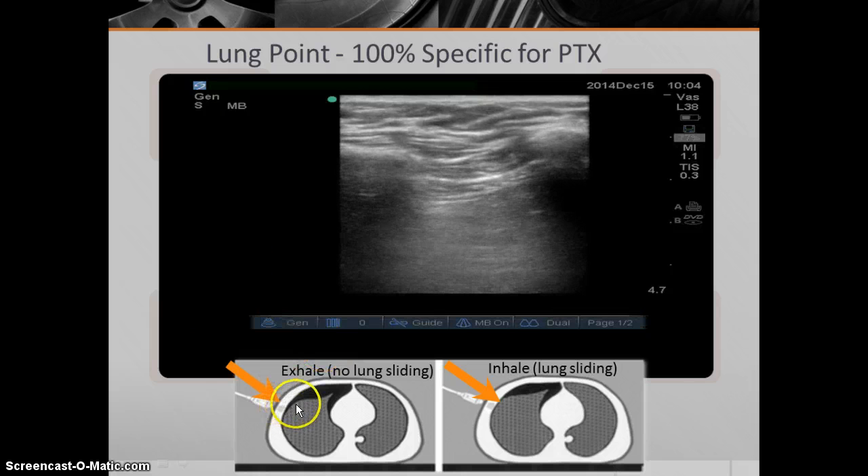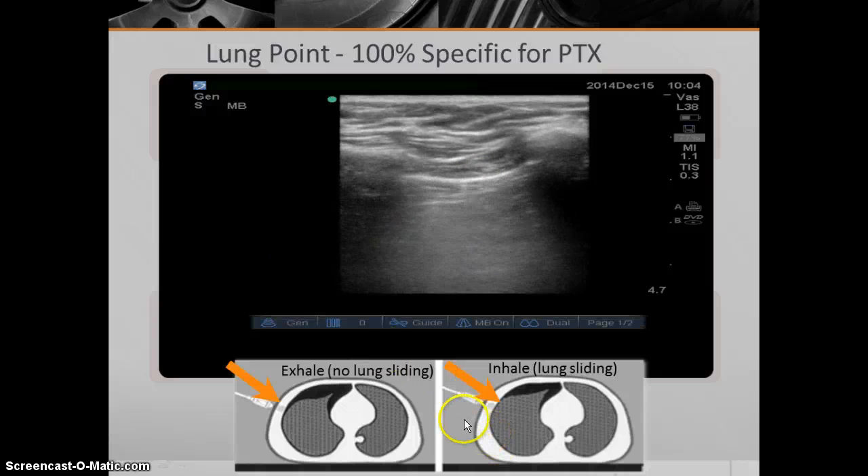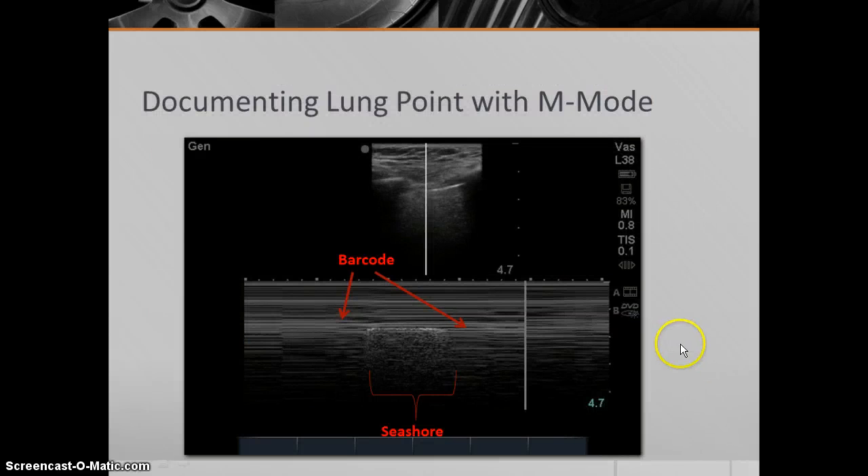When you scan laterally, you can sometimes detect what's called a lung point sign. As the person exhales, the collapsed lung moves further away from the parietal pleura and you get no lung sliding or artifact pattern. But when the person inhales, the lung comes back up a little bit — even though it's partially collapsed — and you can start seeing lung sliding again at that particular site. You're seeing lung sliding come back and forth, with comet tail artifacts appearing intermittently. A lung point is 100% specific for pneumothorax. On M-mode imaging, a lung point looks like intermixed barcode sign and then seashore sign and then barcode sign again.